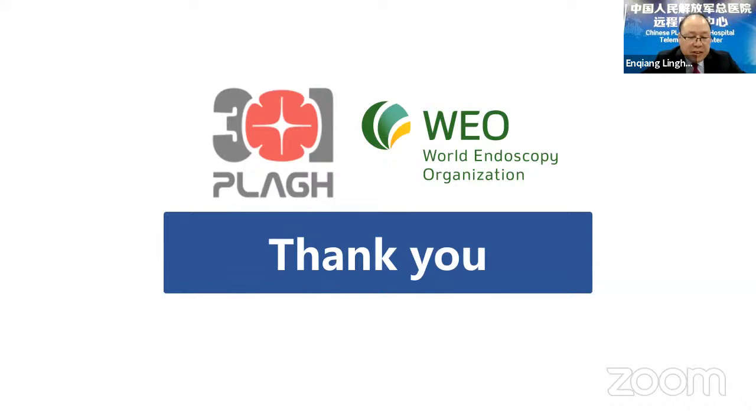Okay, thank you very much. SIMS is applied to most benign disease and malignant disease in the early stage. Although SIMS is believed to achieve a therapeutic effect similar to that of surgical treatment, it fails to treat advanced cancer. Nowadays, MIS is my approach for the resection of lesions. While more and more disease is diagnosed in the early stage, SIMS will be widely used and be the leading surgery in the future. MIS will be the supplementary treatment method for SIMS.